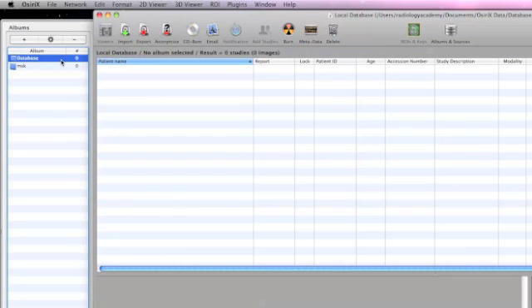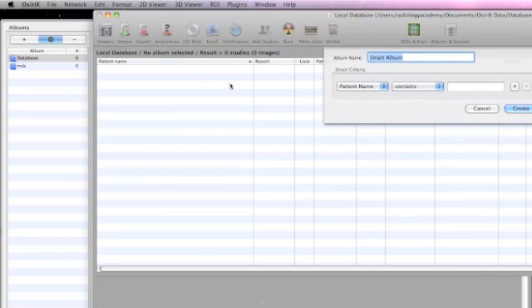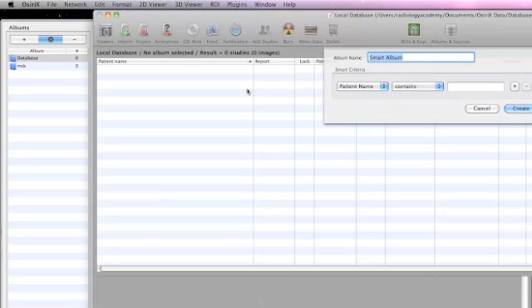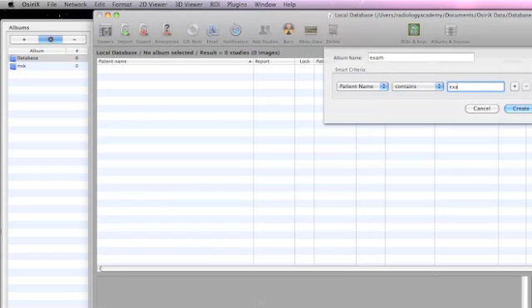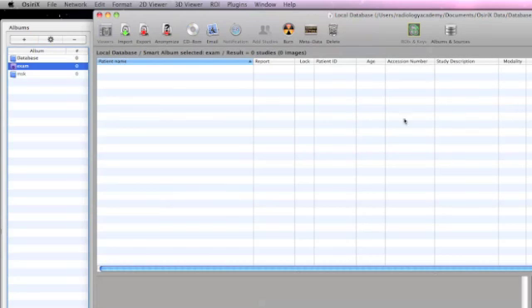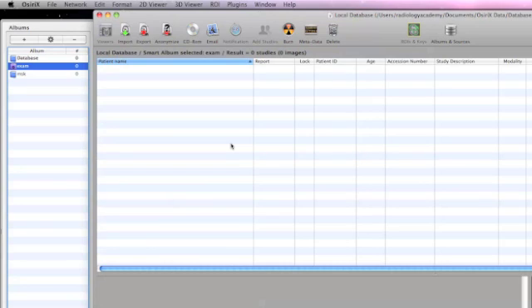We can also generate a smart folder. A smart album allows us to generate a series of cases with a specific name, like exam folder, containing exam case 001 or exam case 002. Any case we add which has a patient name or identifier as 'exam,' irrespective of any subsequent numbers, will be added automatically to this smart folder. That's quite a useful function.